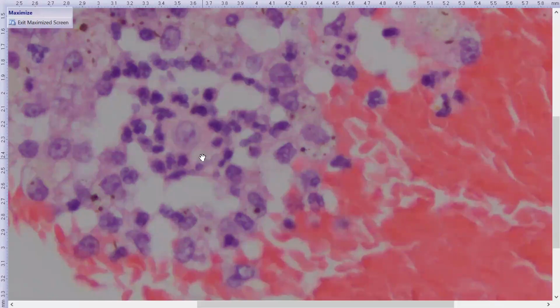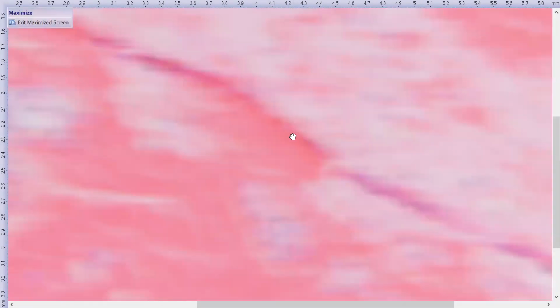Because it is hard, with some of our technology, to differentiate from other cells. But this is a round cell. It has a very thin, somewhat poorly staining wall, and then a big basophilic nucleus in the middle. And you see these neutrophils clustering around, and then the macrophages clustering around that. So this is a yeast organism at the center of a pyogranuloma. You may have to somewhat trust me on that. It is, I promise.